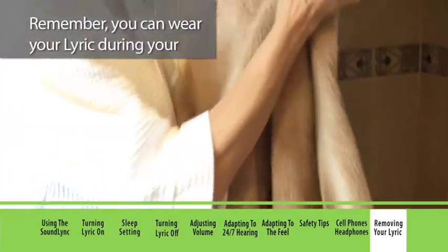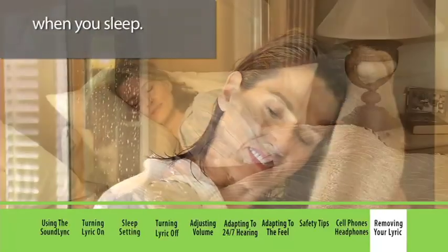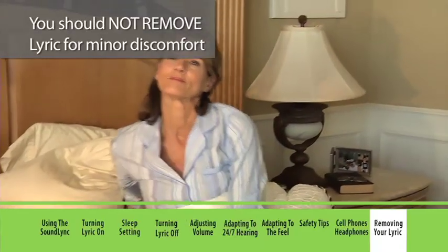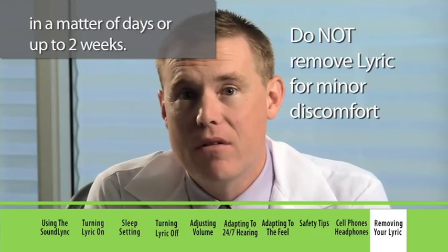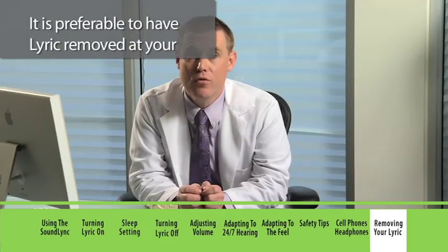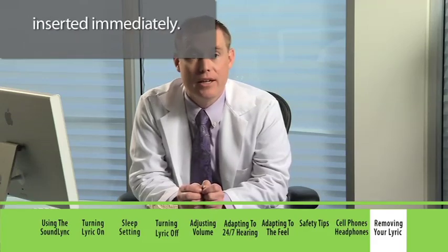Remember, you can wear your Lyric during your daily activities, including when you shower and when you sleep. You should not remove Lyric for minor discomfort during the first few days of wear — this discomfort is usually short term and goes away in a matter of days or up to two weeks. It's preferable to have Lyric removed at your hearing professional's office, as this will allow you to get a new Lyric inserted immediately.